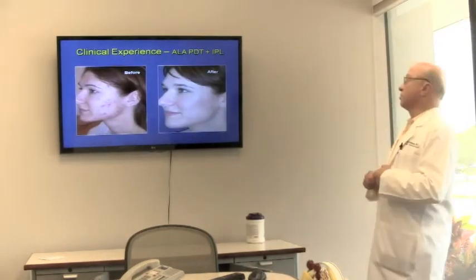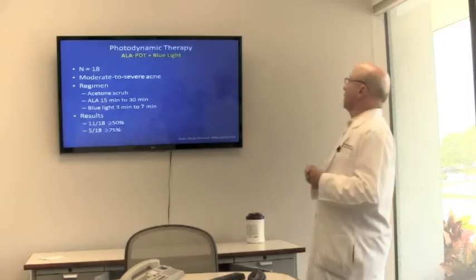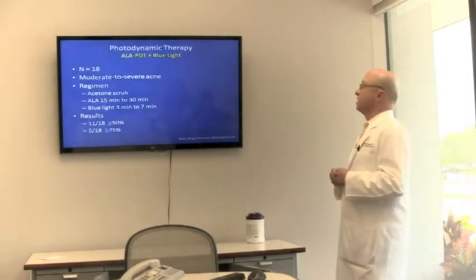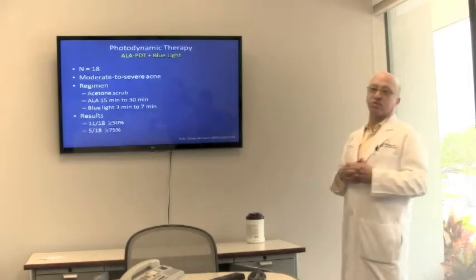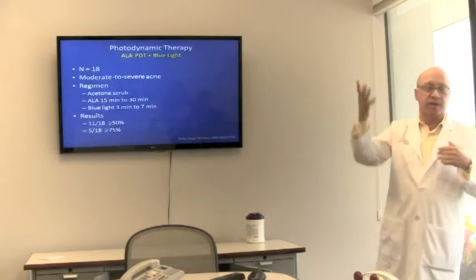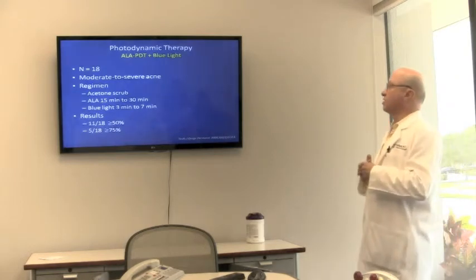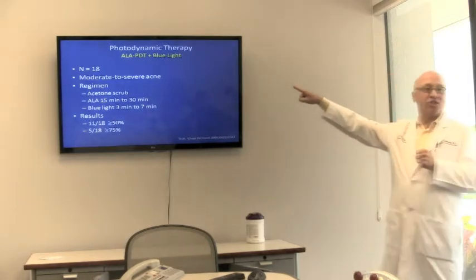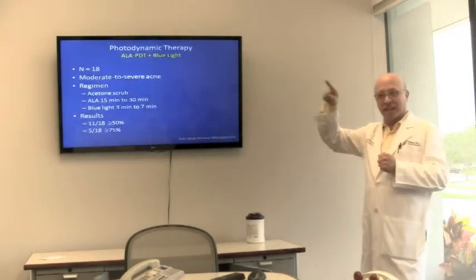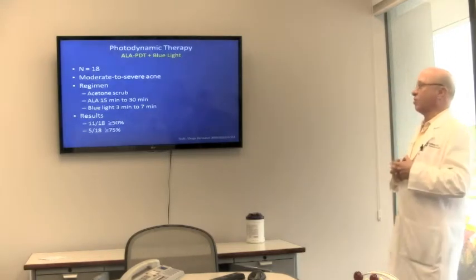Here's another one. It's a great example. Another study done by Amy Taub, a dermatologist in Chicago, again, moderate to severe acne. This is her regimen, so she does an acetone scrub. Yeah, you kind of want to get all the oil off the skin before you put the ALA on. That applies no matter who you put it on. We don't use acetone, we tend to use alcohol, but you can use either one. And here, she's really cheating, because she's putting the ALA on for 15 minutes, 30 minutes, not an hour. And that's part of what the acetone allows you to do, is you're really ripping off some of that outer layer. You know, we tend to put it on for an hour.